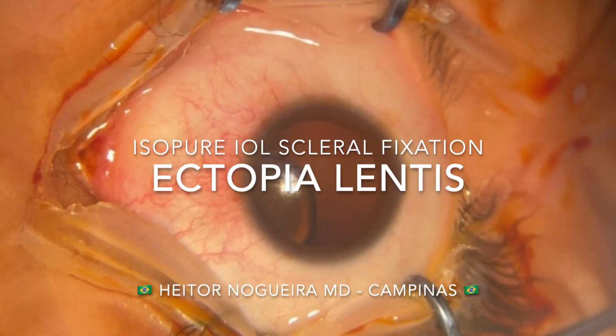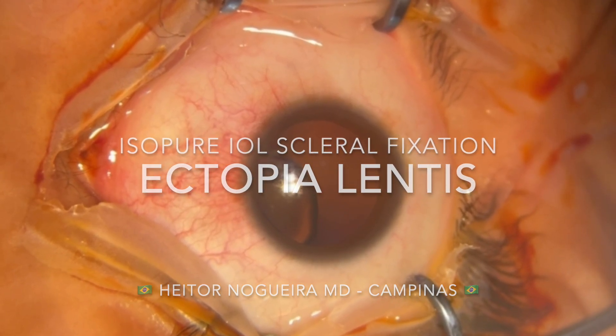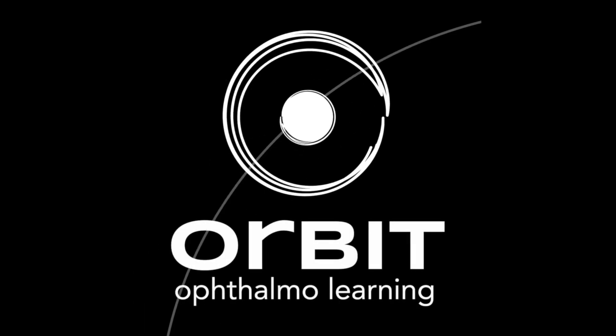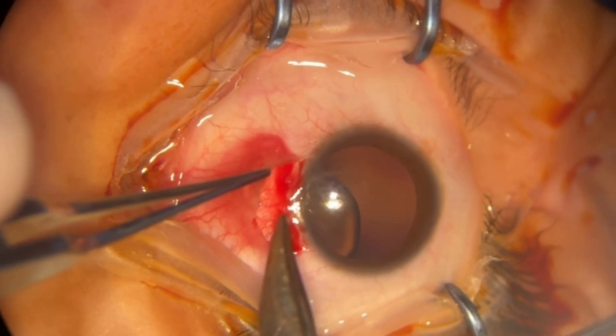In this video, shared by Dr. Heitor Nogueira from Campinas, Brazil, we will discuss the surgical management of a case of ectopia lentis. The surgeon plans to perform lensectomy with scleral fixation of an isopure intraocular lens using CV8 Gore-Tex sutures.